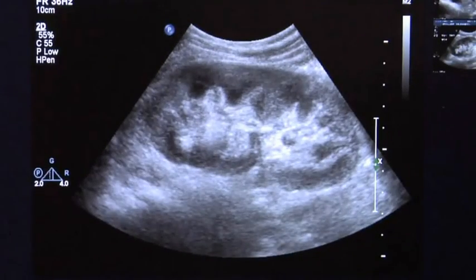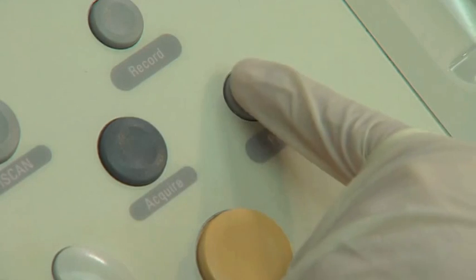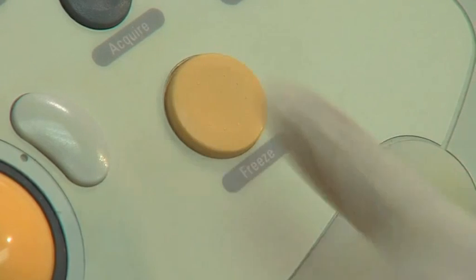Freeze and annotate 3 separate longitudinal images of the right kidney, one for each of the medial, mid-sagittal, and lateral views. Obtain a measurement of the length of the kidney in the mid-sagittal view from the superior to inferior pole. Print or save the image and then press the freeze button to continue.